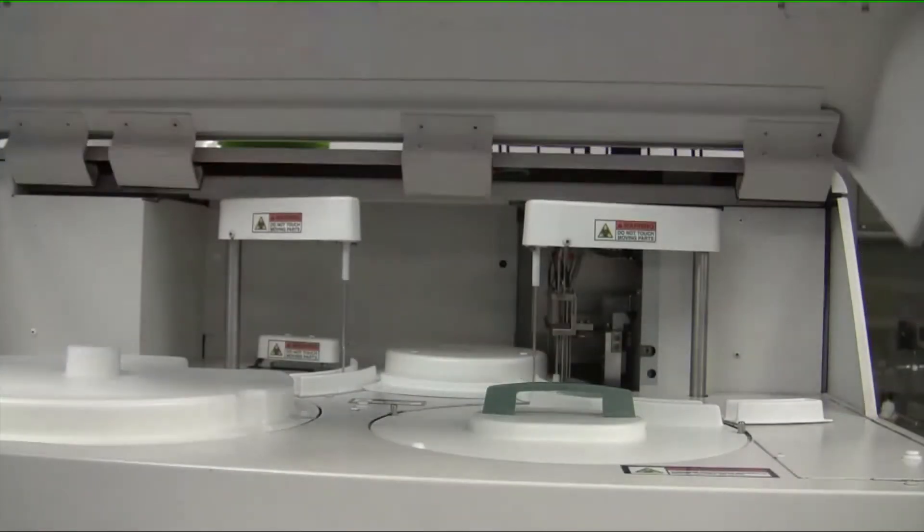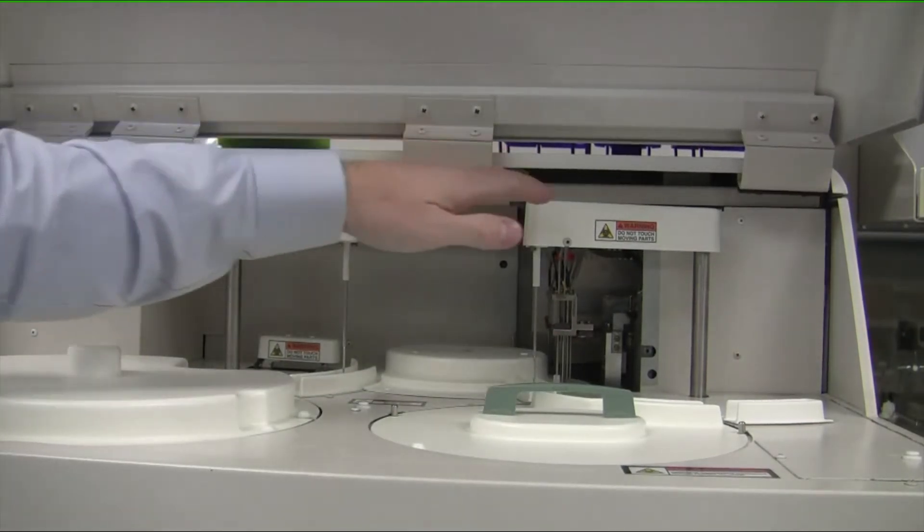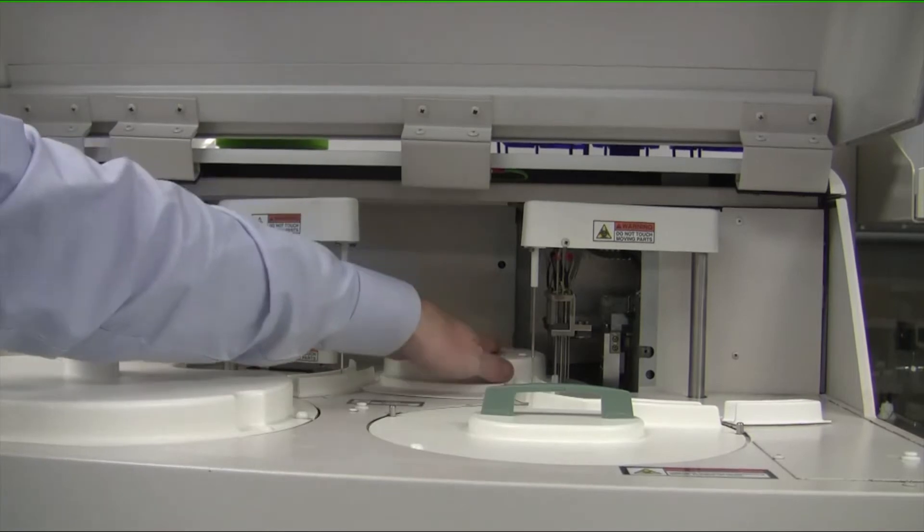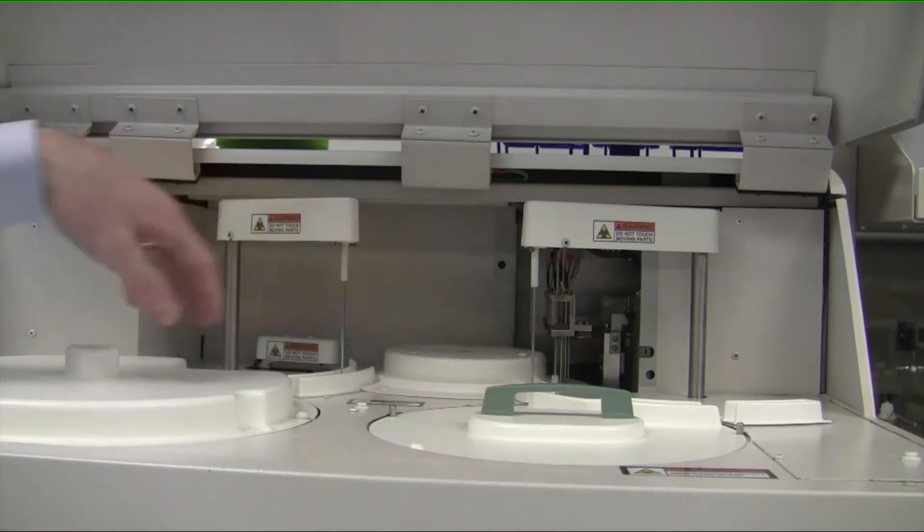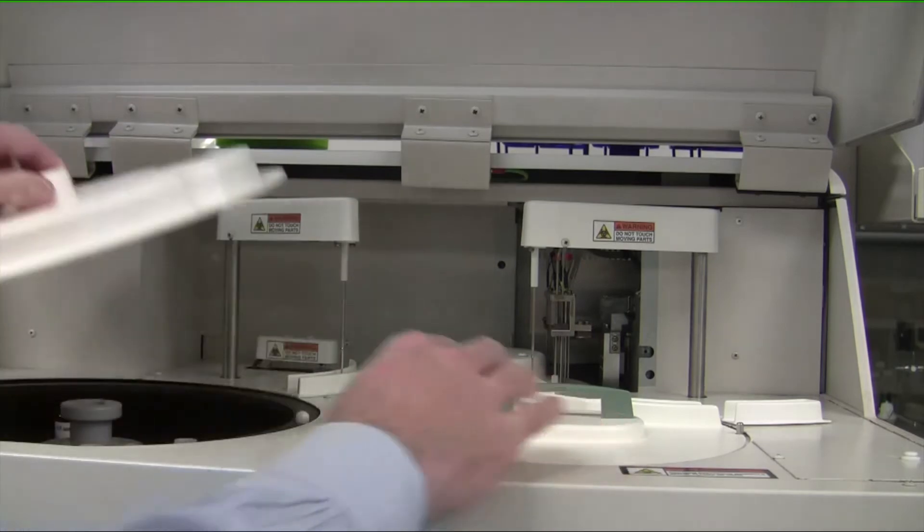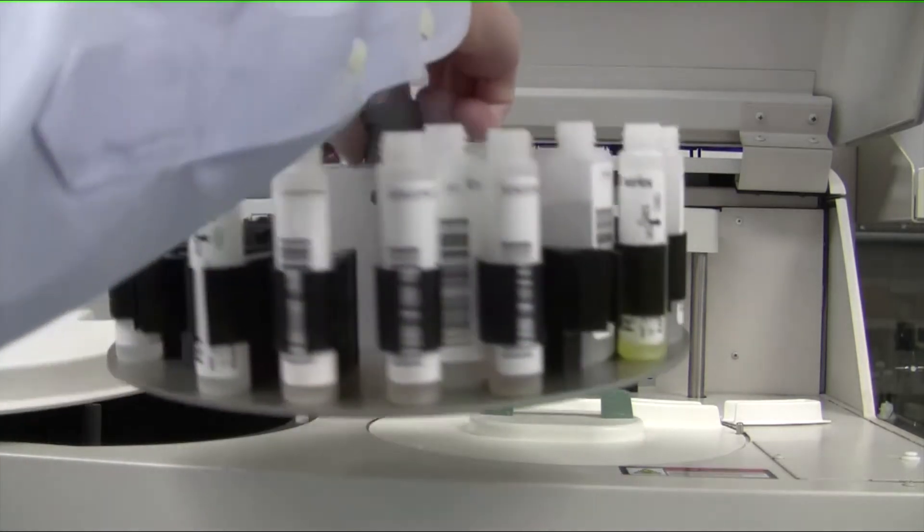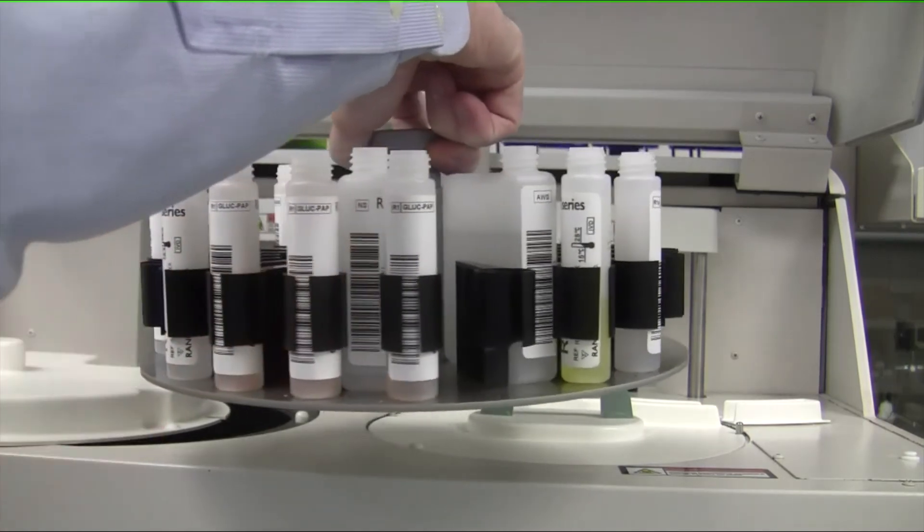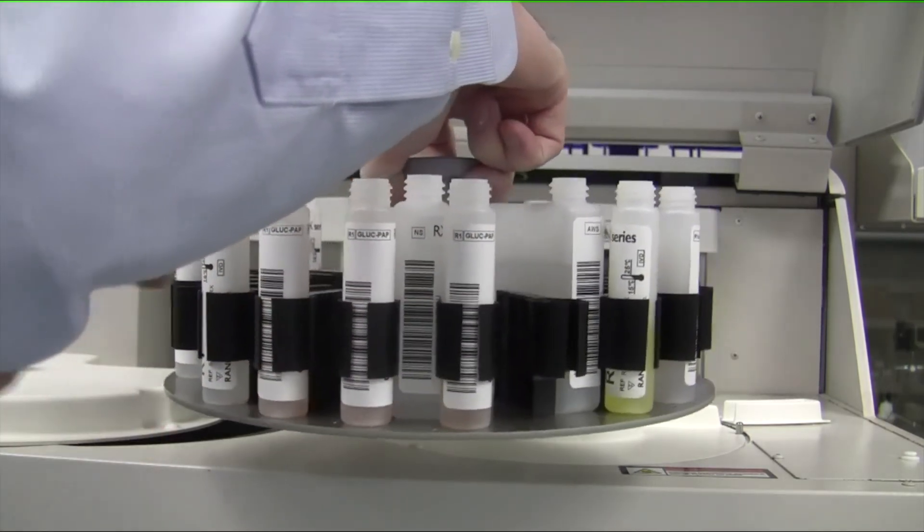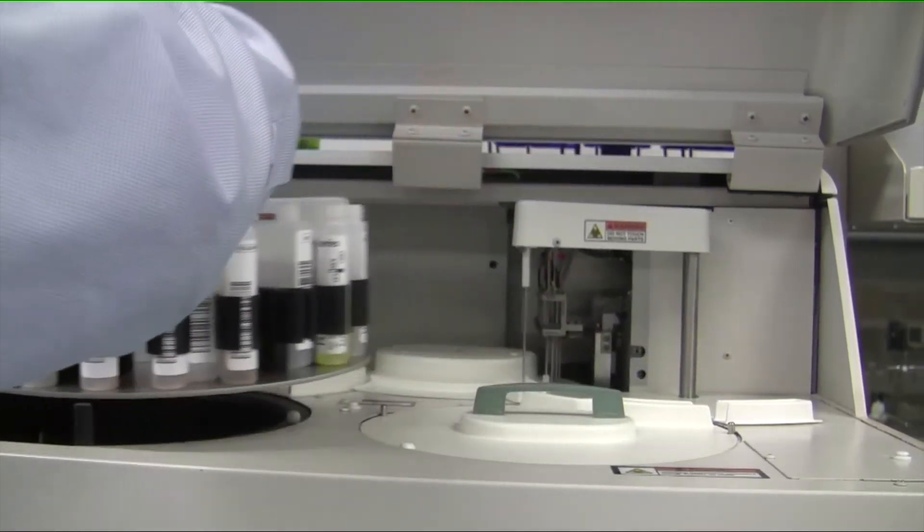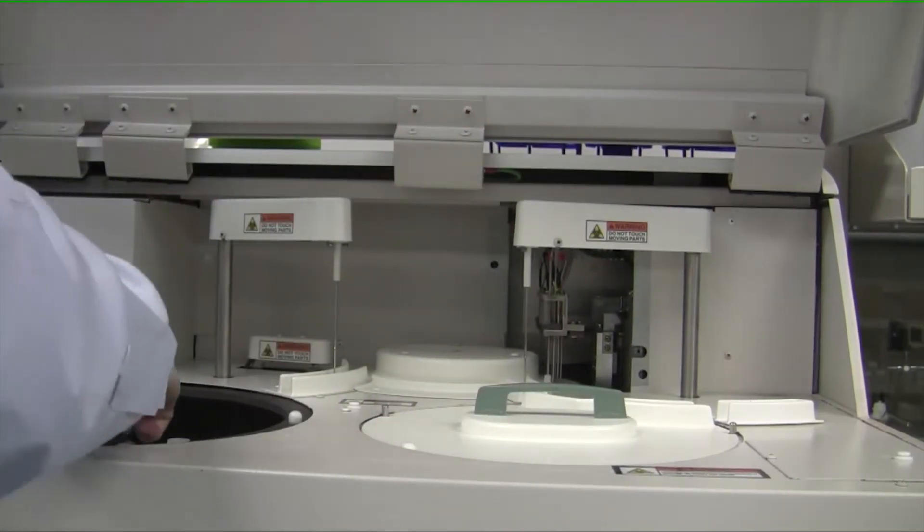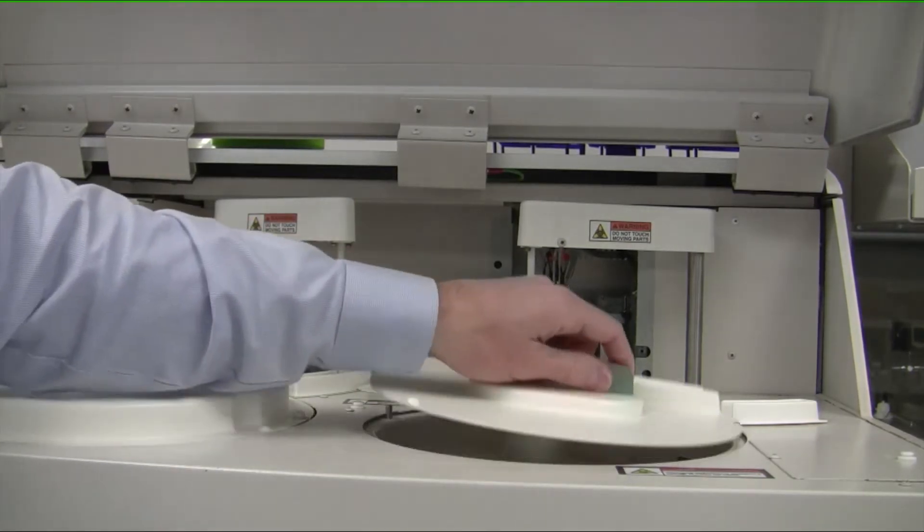If you open up the lid of the instrument, you're going to see that there's two pipetting arms, one mixer. Underneath here is where all the cuvettes are stored, and then we have two chambers here. One is for the reagents, so each bottle itself would be for a specific reagent and they're barcoded. We just place the barcode out, and when we put it into the chamber with a click of a button, the instrument will automatically recognize what reagents are on board.